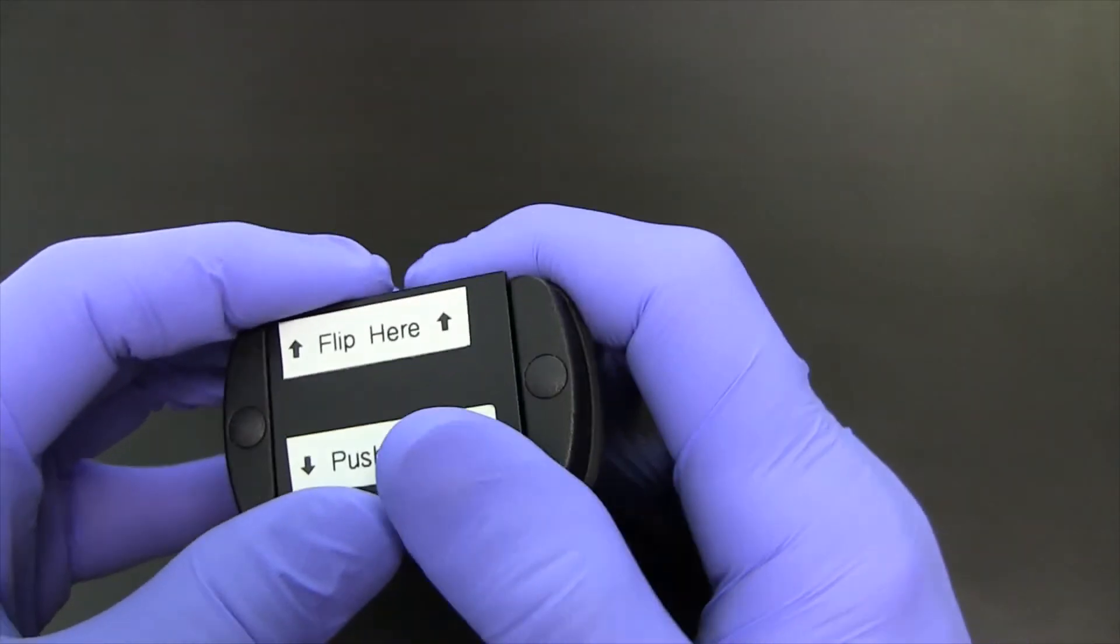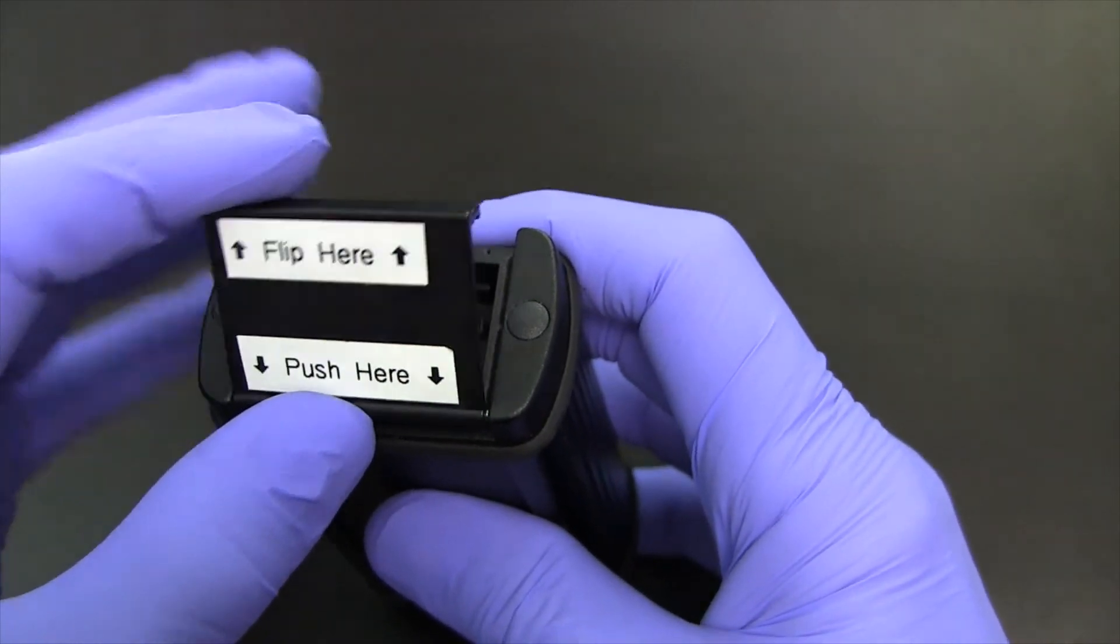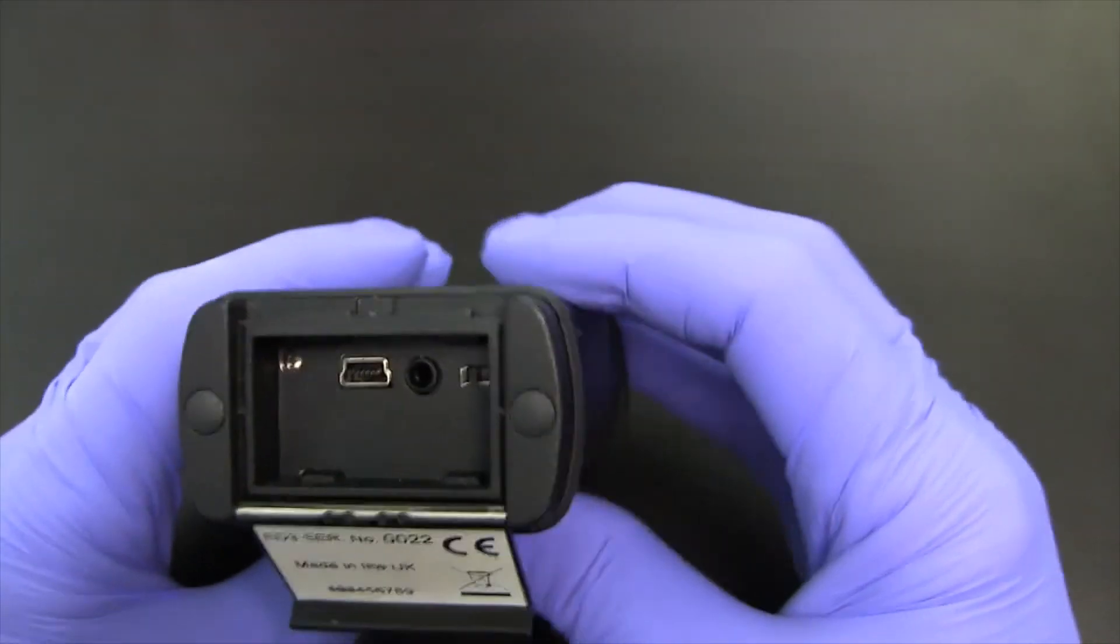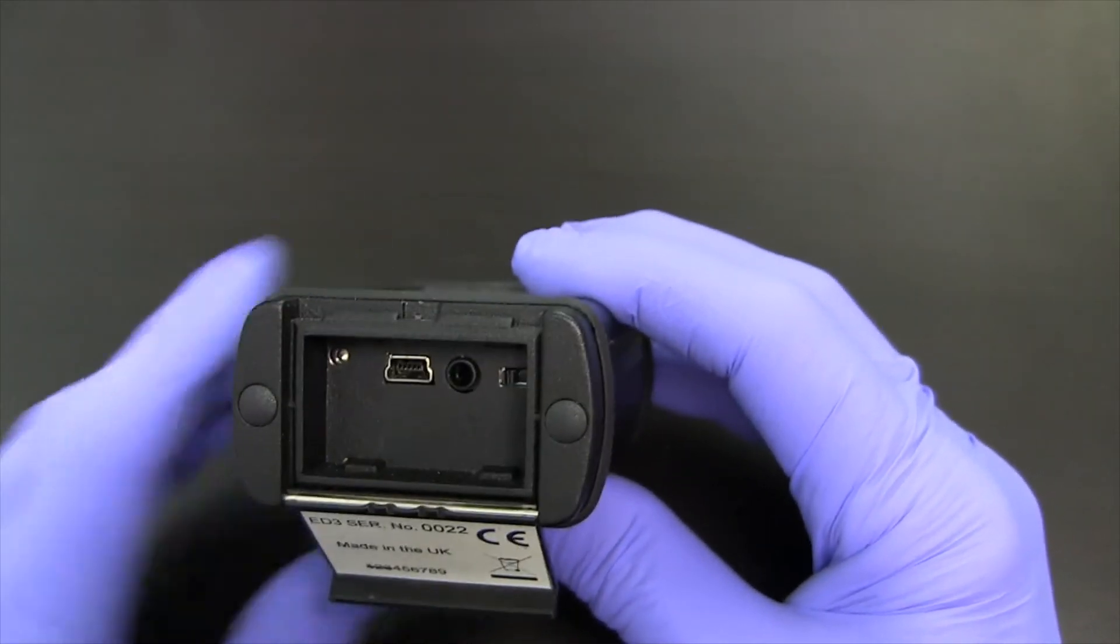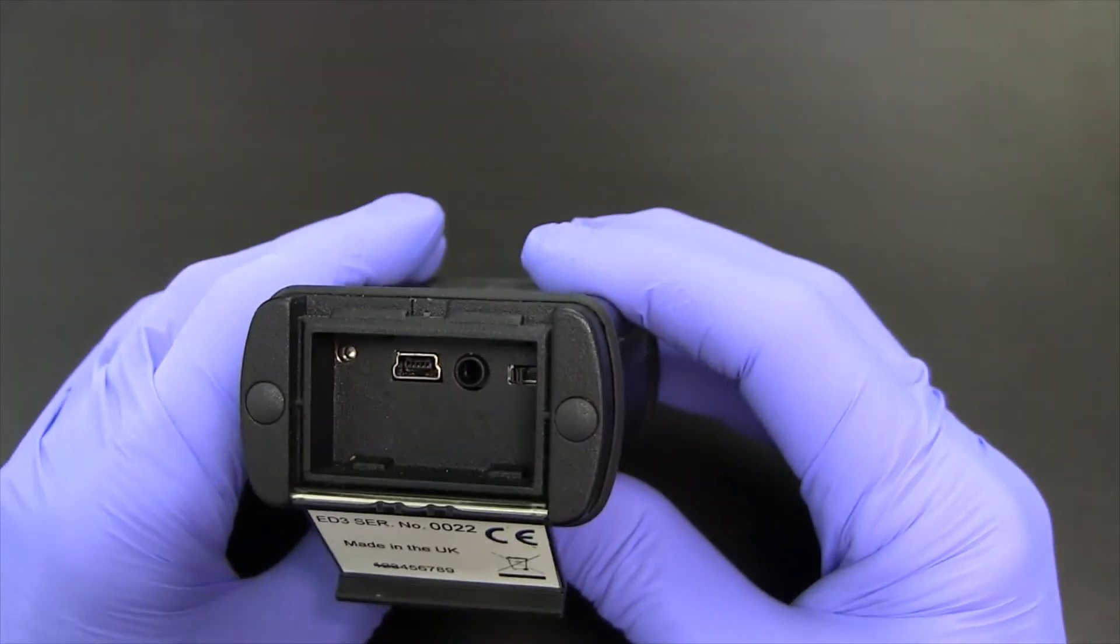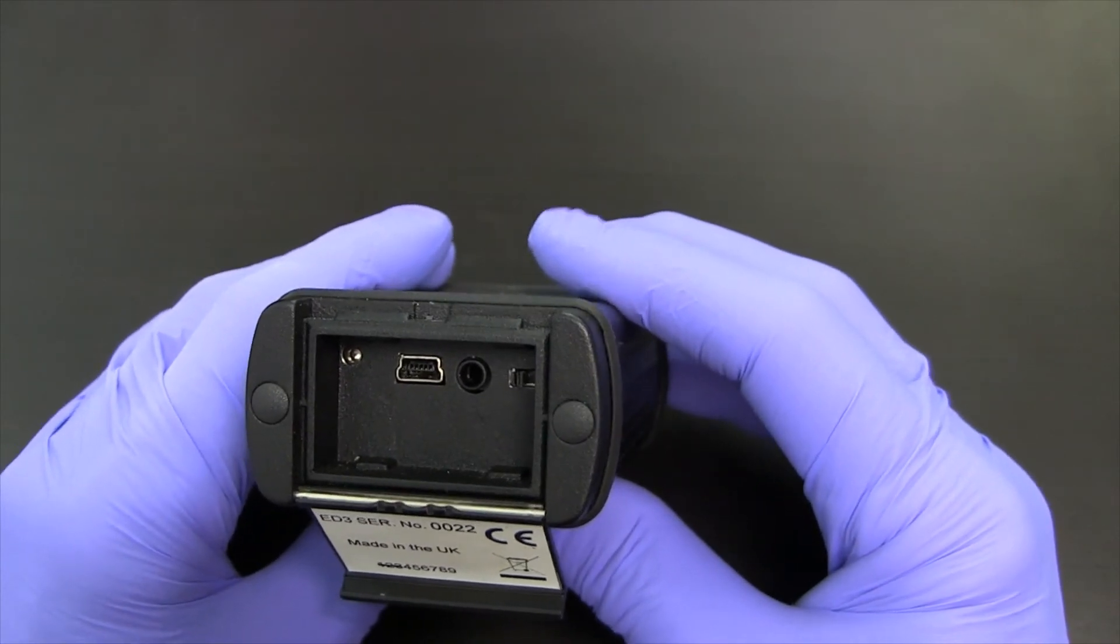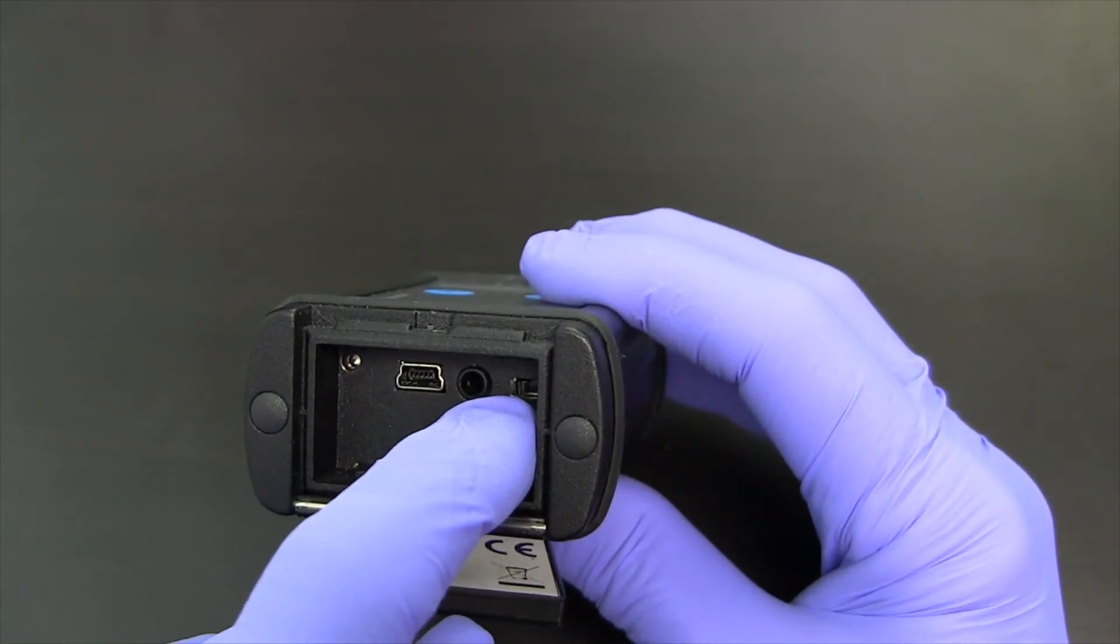On the back, you push on the back end here, and then flip the unit open, and you'll see connectors for USB, which is a way to extract the data from the unit after use, a power adapter for charging the internal battery, and then also switch to turn the unit on and off.